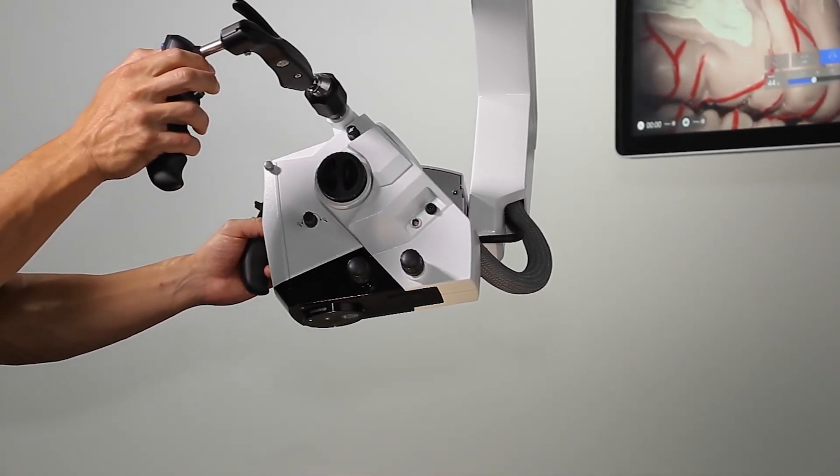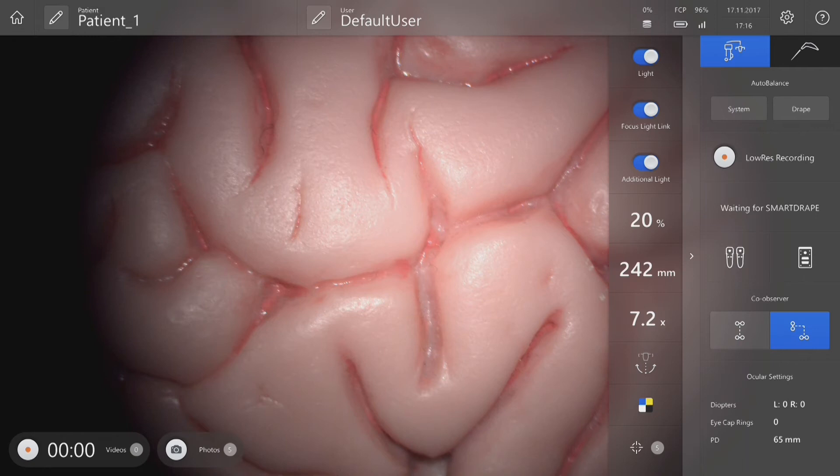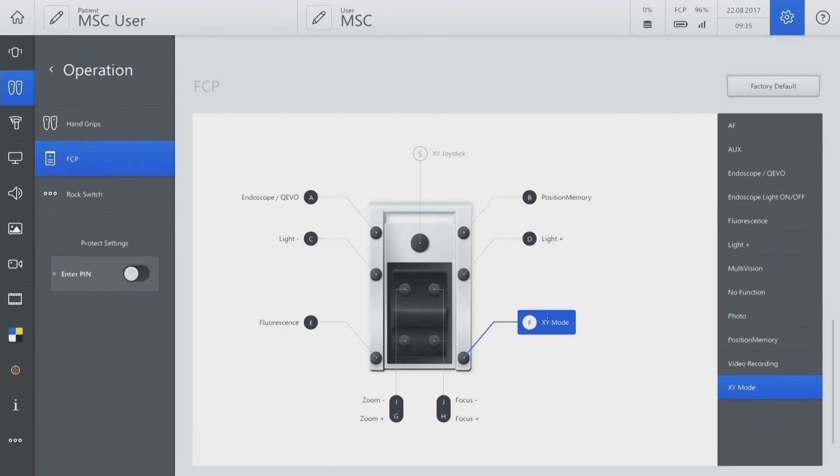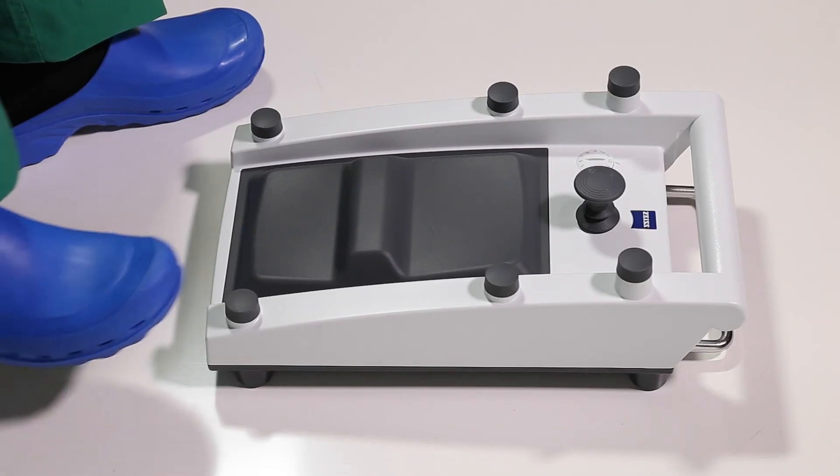To enable hands-free movement, configure the foot control panel for different motorized movements. Go to the icon from the main screen. Go to Adjust Settings. Configure XY mode to one of the buttons. Pressing this button enables toggling between different modes.